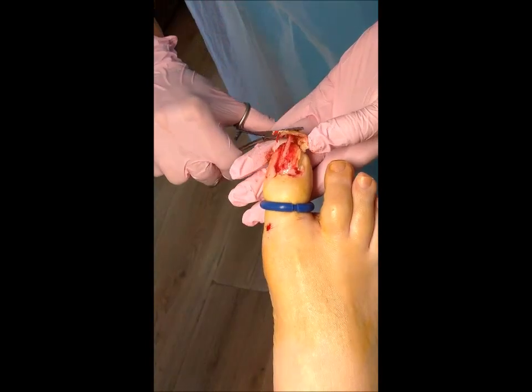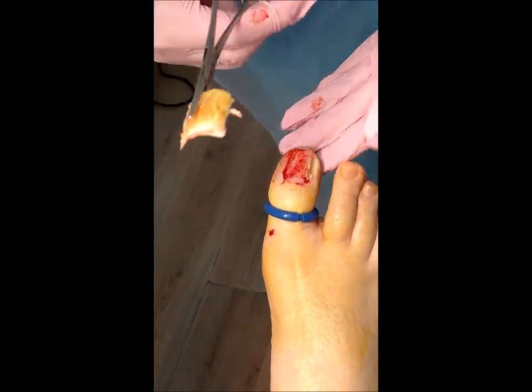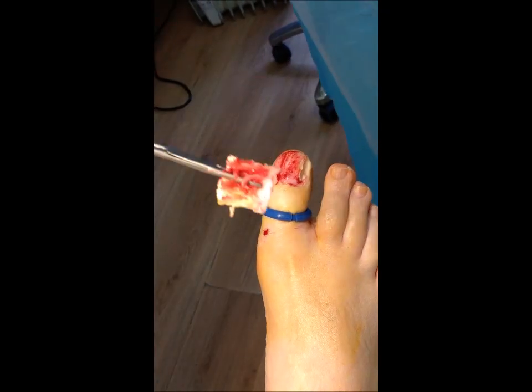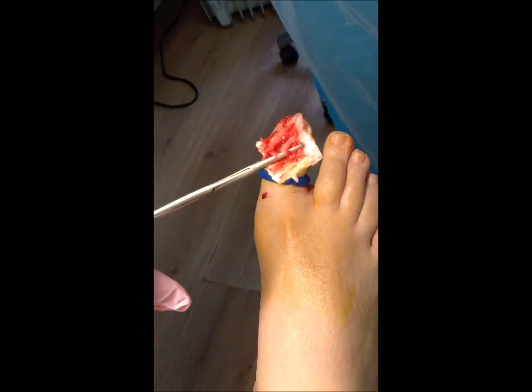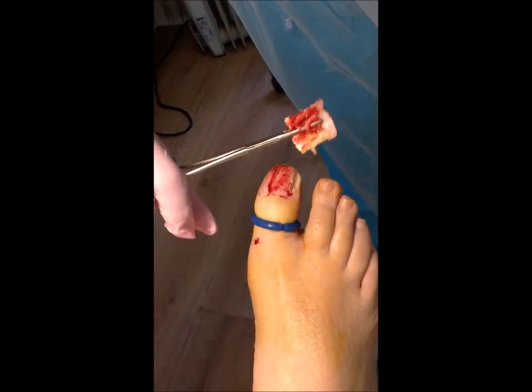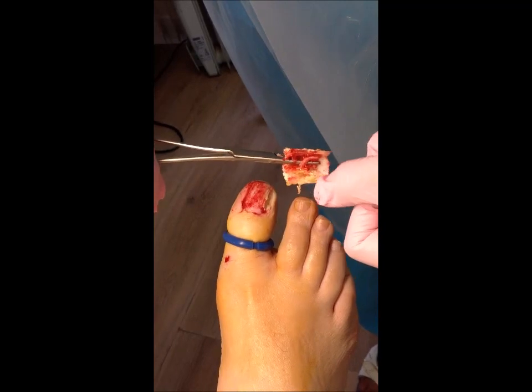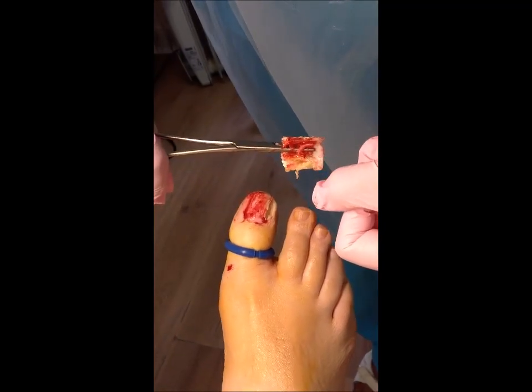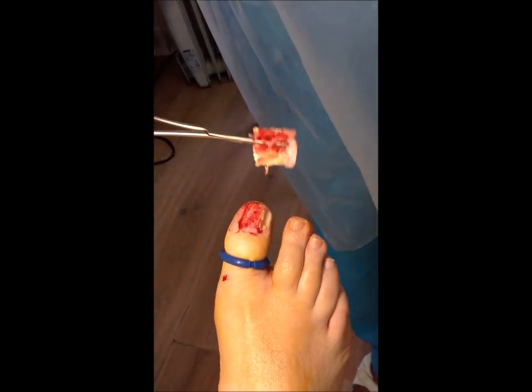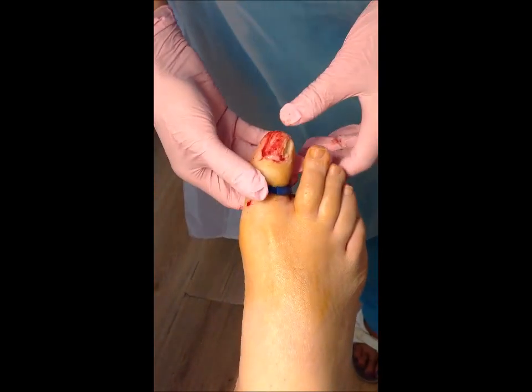So now I'm just going to take that nail off — there we are. There's a little bit of fibrous tissue there from where it was attached, and that is the underside of the nail. If you look at that, you can see how diseased it was underneath. And if you look again you'll see the yellowing under there where the infection is, right down on the nail base.